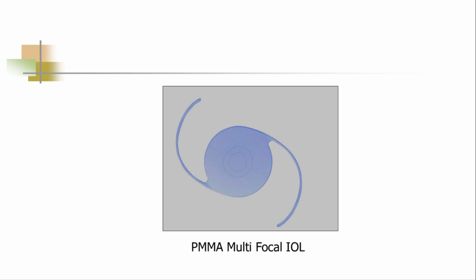The central zone is 1.5 mm wide and is adapted for distance vision. The second zone from the center out is the zone with maximum addition and has a power that is 4.5 diopters greater than the power in the central zone. This zone is adapted for near vision. The second zone has a diameter of 2.5 mm and the third zone has an addition of 1 diopter over the central zone power and extends up to the periphery of the optic of the lens. This zone is adapted for intermediate distance vision.